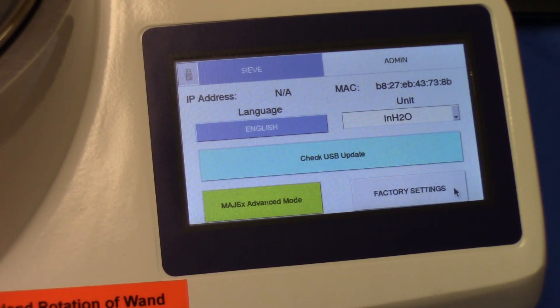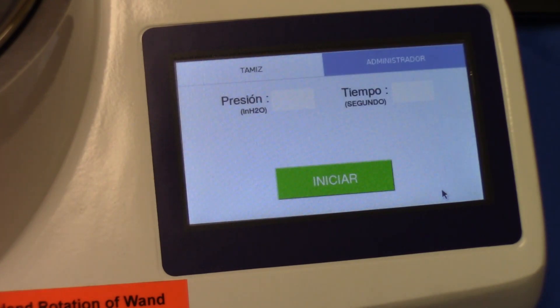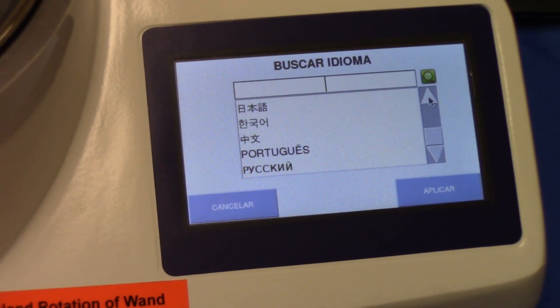Let's talk about the admin page. This model is quite diverse — on this page the operator has the opportunity to change the language displayed in the software. We'll demonstrate changing to Spanish: the software restarts and converts the words to Spanish. Available languages include Hindi, Dutch, French, German, Italian, Korean, Chinese, Japanese, Portuguese, and Russian — all selectable so the operator can use the instrument more easily.